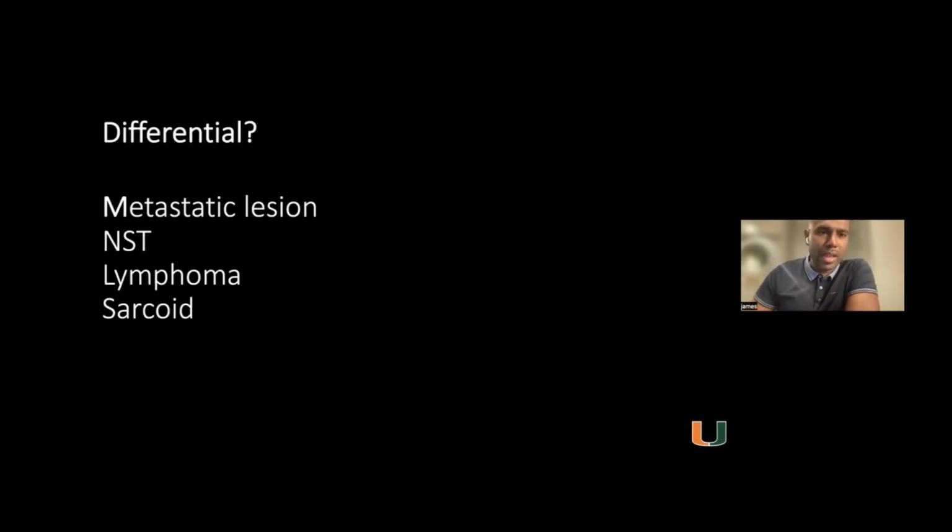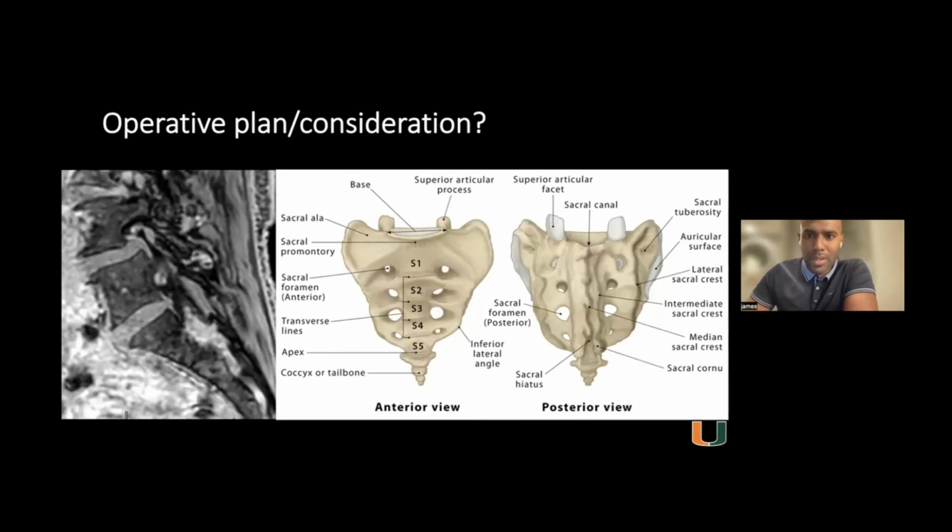So the biggest thing I was trying to get at is that, yes, it's mostly within S1. It's not higher up. I have a little marker showing right around where it is. It's right in this area where the red box is, on the right side under the S1 lamina. So obviously we need to go in and get a biopsy of this lesion, right?